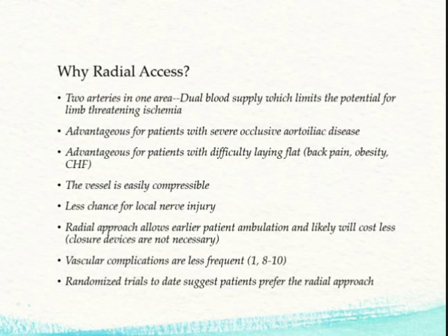The other thing is that a radial artery is extremely easy to compress. There is less of a chance for local nerve injury. It allows for earlier ambulation. Complications are less frequent, and patients usually prefer a radial approach.